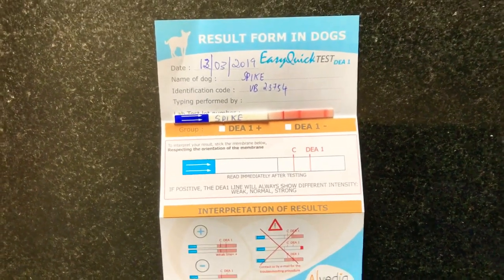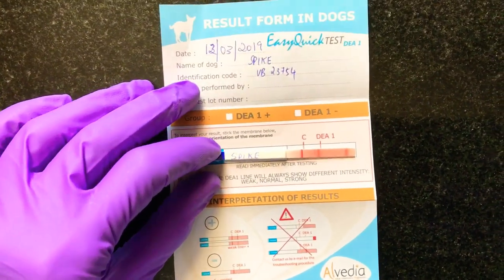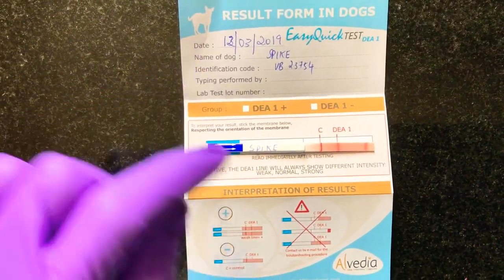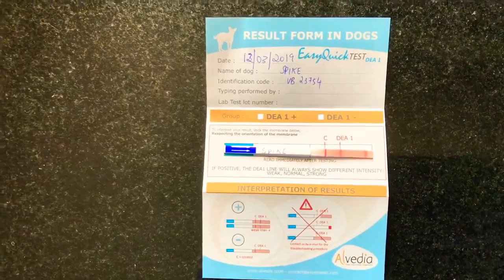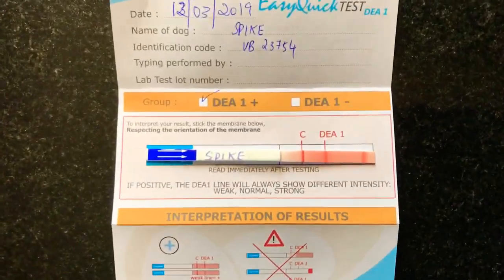Once the control line appears, take out the membrane and start comparing the membrane with the guidelines given in the leaflet. As you can see, this sample was DEA1 positive.